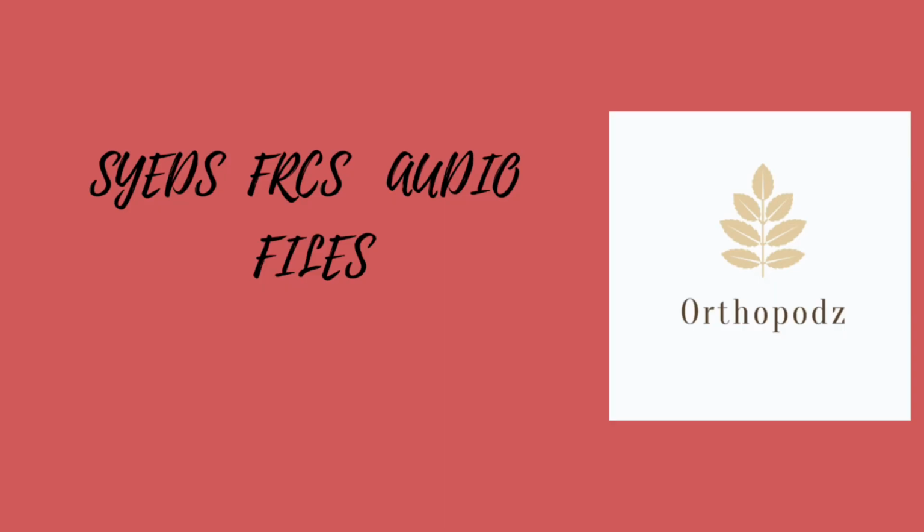SPECT scan, single photon emission computerized tomography, is a 3D bone scan. Images are reconstructed in axial, coronal, and sagittal planes.